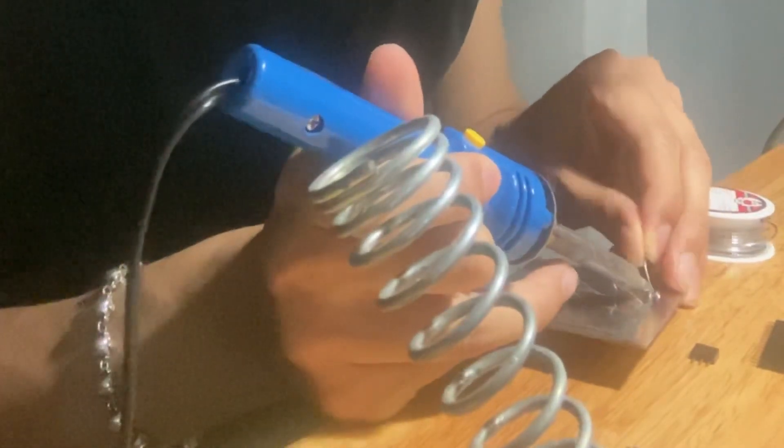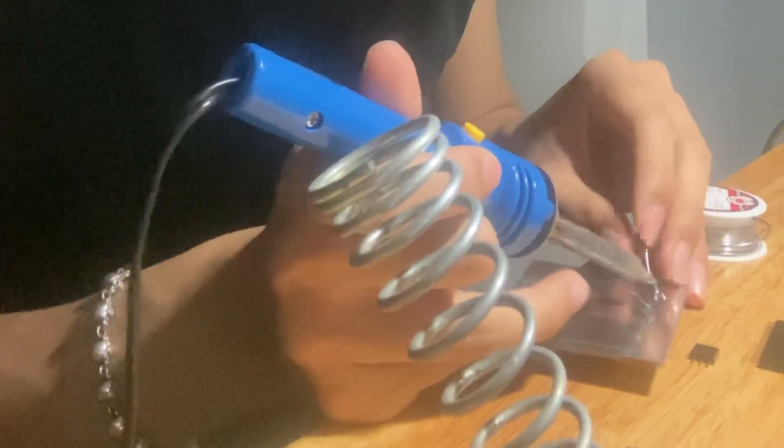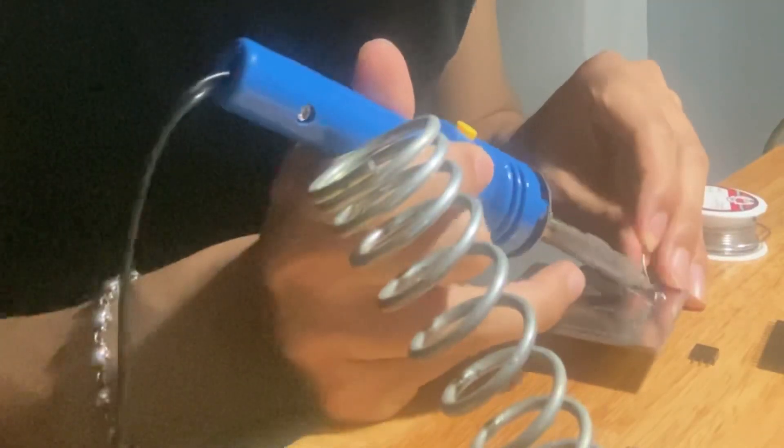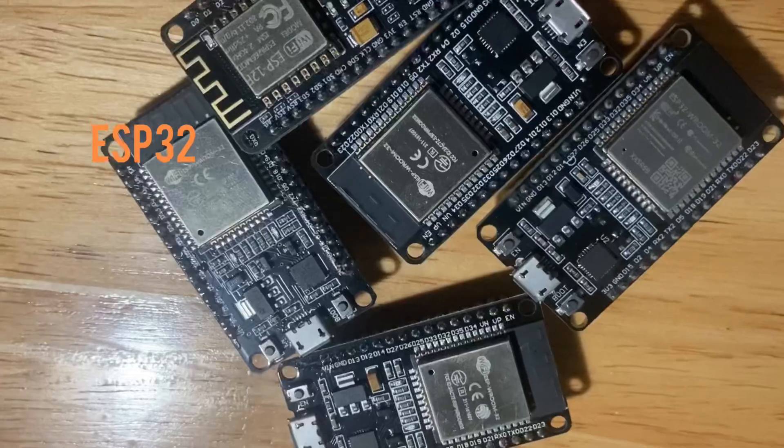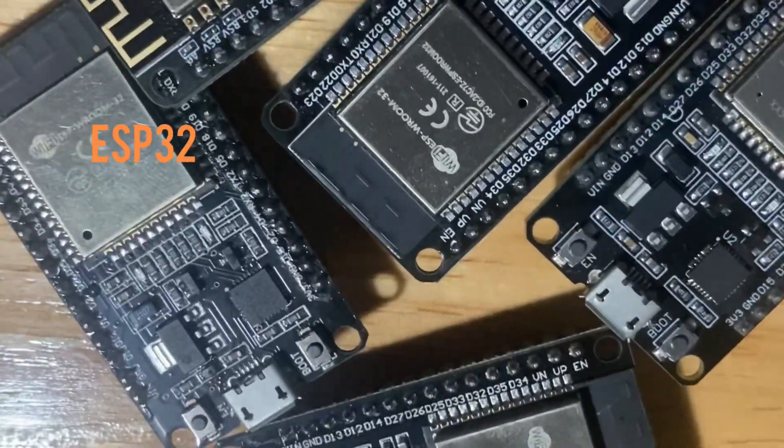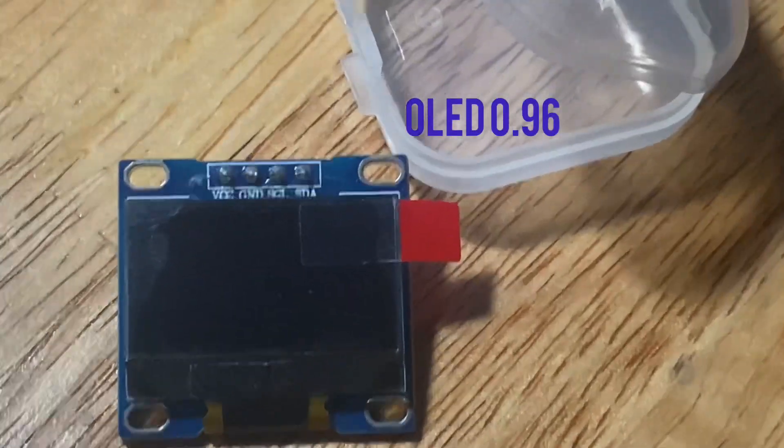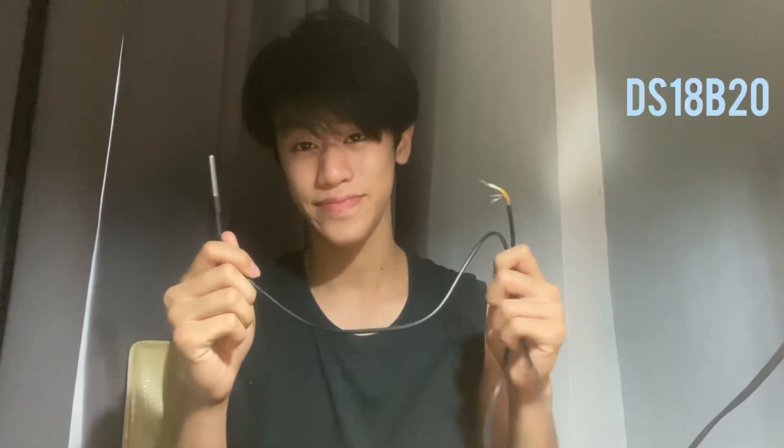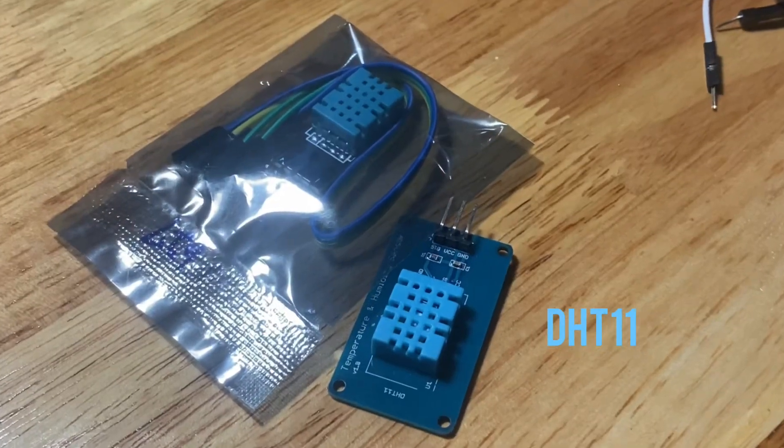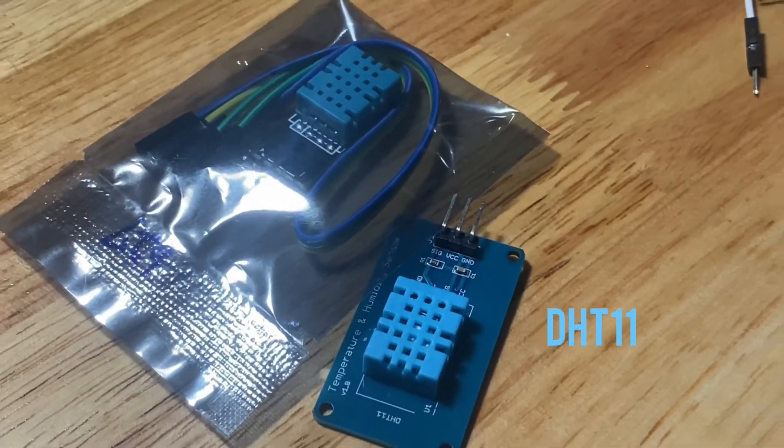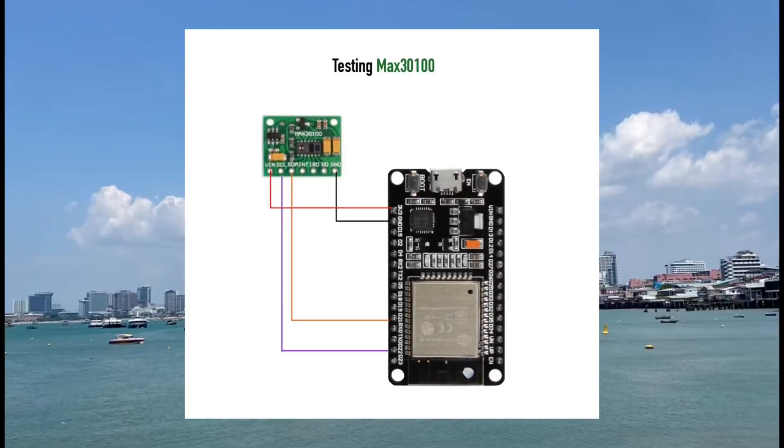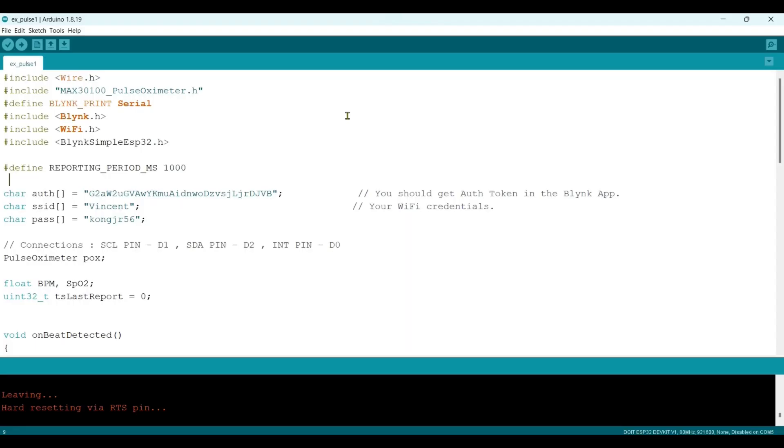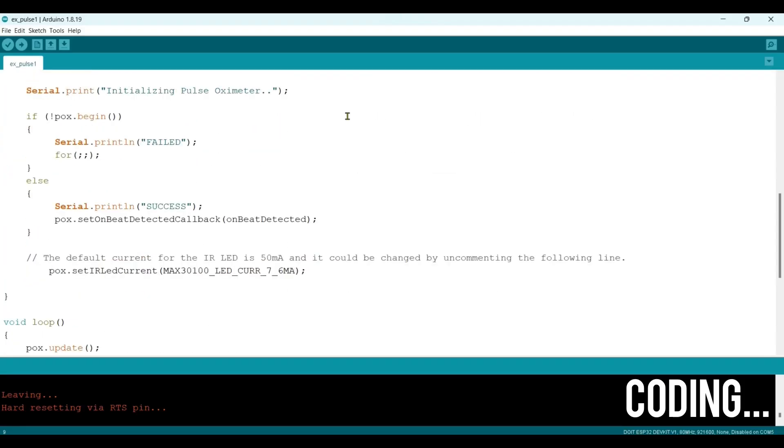At first, we will take a look at the components that we will use in this project. We have to test the Max 30100. Does it work or not?